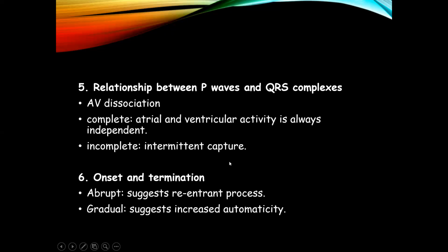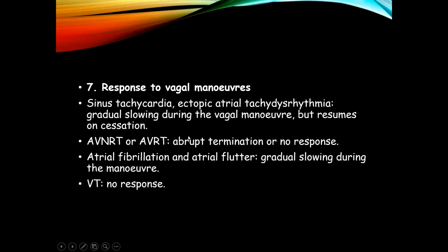Onset and termination. If there's an abrupt onset, it can suggest a re-entrant process, and if it's gradual, it suggests increased automaticity. Response to vagal maneuvers: sinus tachycardia and ectopic atrial tachydysrhythmia show gradual slowing during the vagal maneuver.